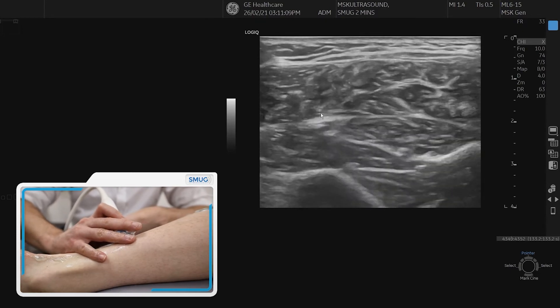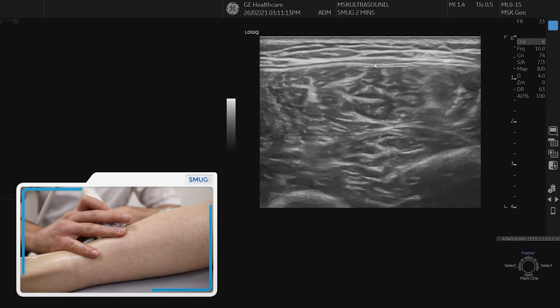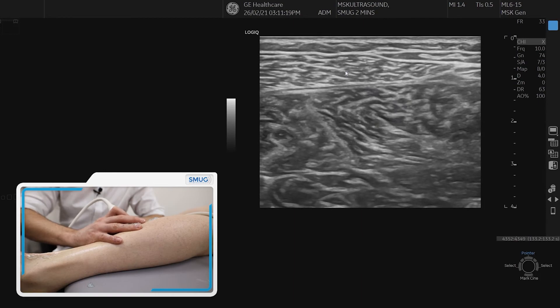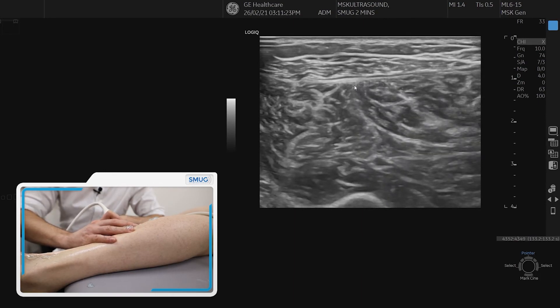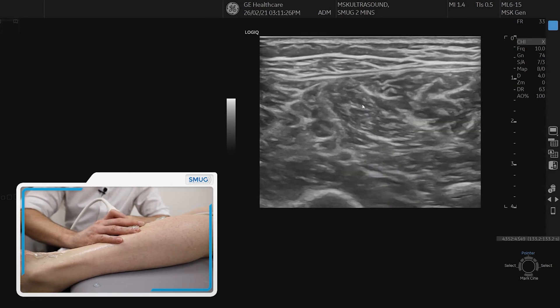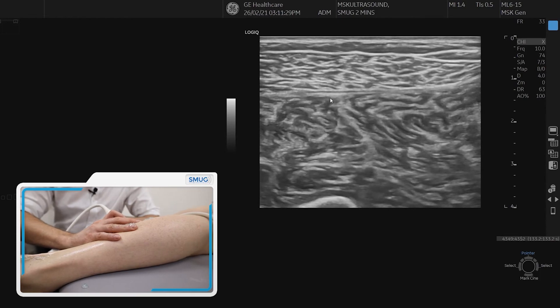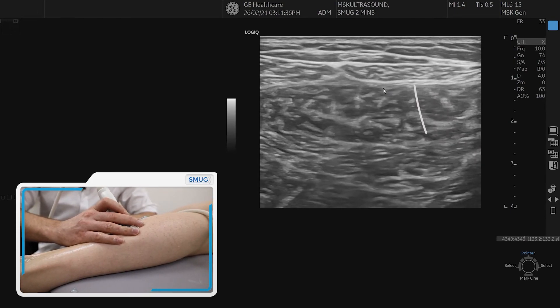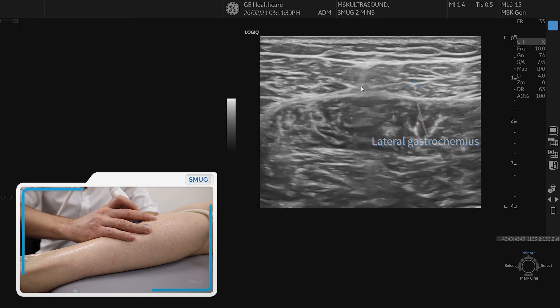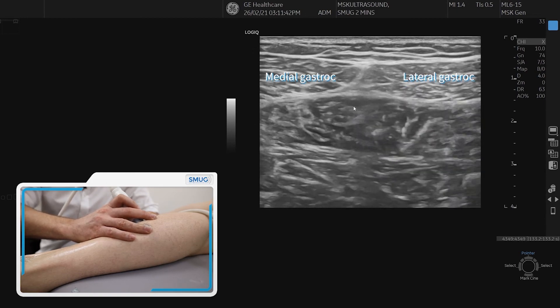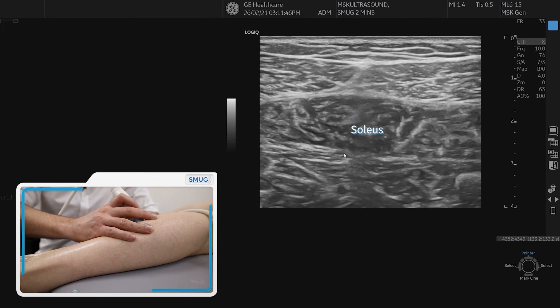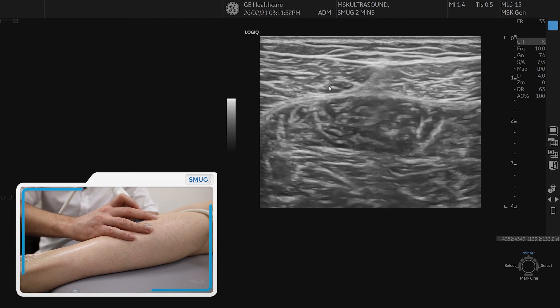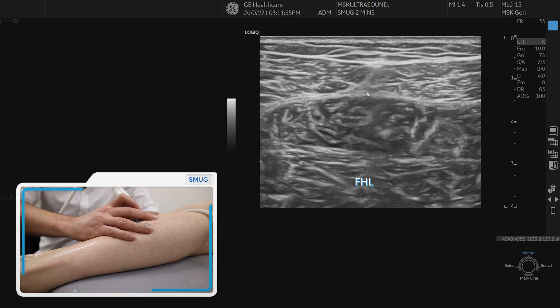Following up medially, the Achilles goes deep to the medial gastrocnemius, which becomes visible with the aponeurosis, and underneath is the soleus. Moving laterally, the intramuscular septum is visible, then the lateral head. You can then see the lateral head, the medial head, soleus underneath, and FHL beneath that. It's important when practicing to identify the three different angel cake layers — distal, middle, and proximal.